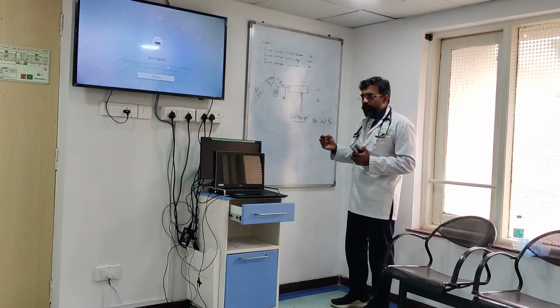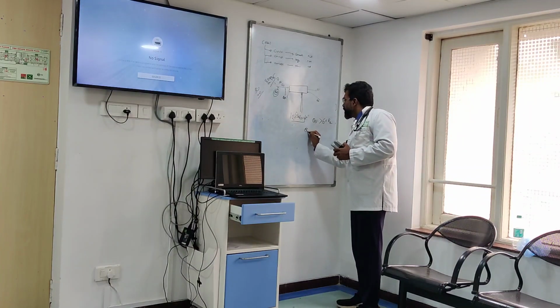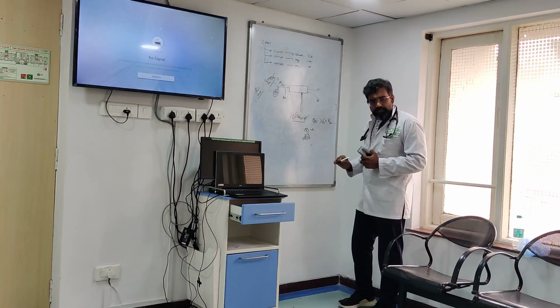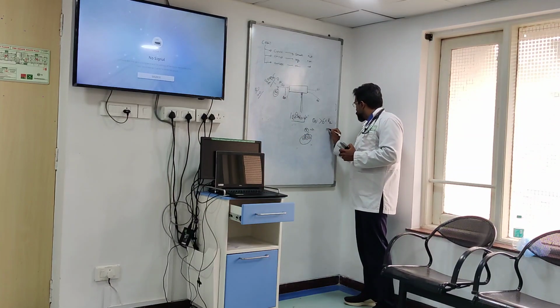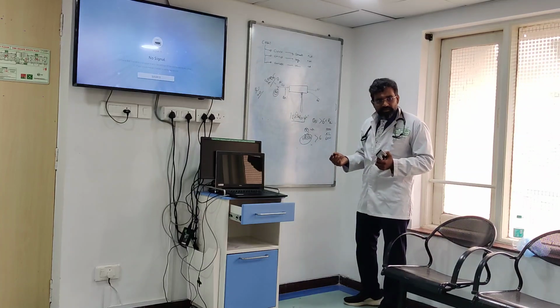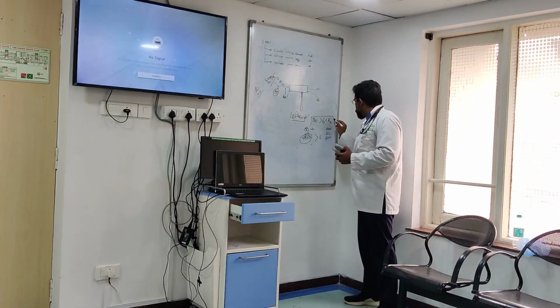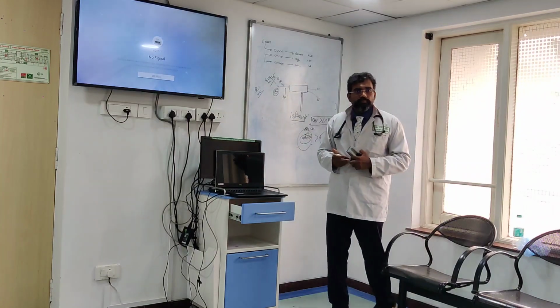So let us take the example of our circuit, 150 ml per minute. So 150 ml per minute into 60 per hour, कितना हो गया? 9 liters. Now let's take our replacement fluid of 1000 into 6, कितना हो गया? 6,000. Is it more than 6 times? It is. It is more than 6 times. This is solving my problem. 150 पे रखा उसको तो समझ में आ रहा है?